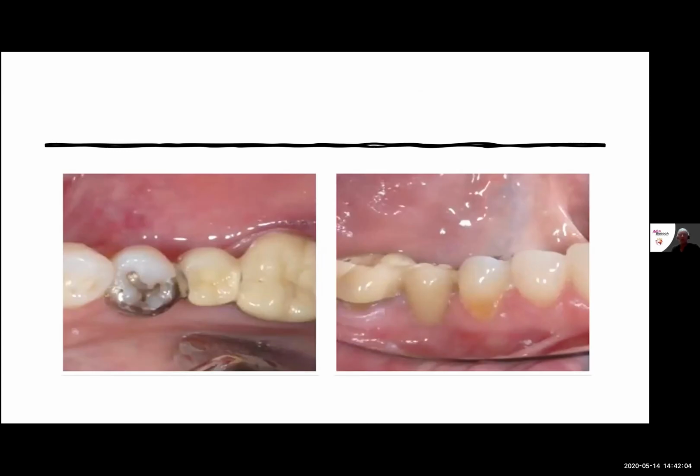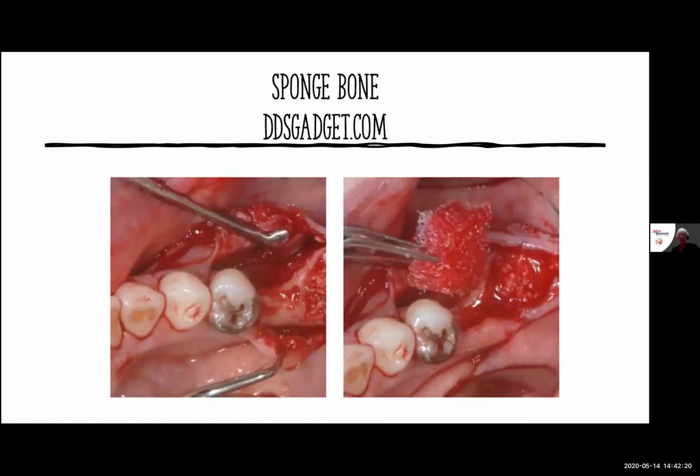And so with this particular patient, this patient's wanting to end up with a couple of implants here. And this ridge has been resorbed down to the point that there is almost nothing left of it. There's a small amount that's present, but there's not enough that we could place an implant there. And so first removing the tooth and degranulating everything, then creating our pores or openings through here is always a key, because this becomes our source of medullary space and bleeding that's coming in.